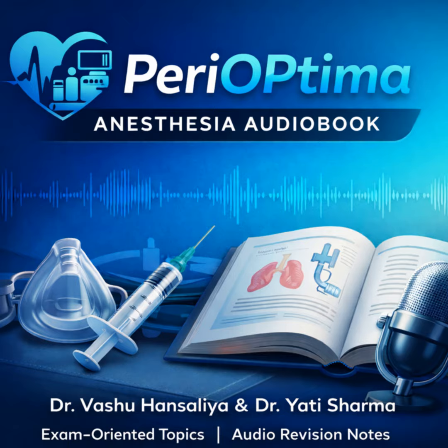Or a pinhole. Use the ice pick analogy. Imagine taking an ice pick and stabbing it through the patient. M mode ignores everything else and just shows you what is happening along that single thin line over time. So it's a graph. Depth on the y-axis, time on the x-axis. Precisely. And why do we care? Because it proves movement. It is the definitive way to prove the lung sliding against the chest wall, or that a heart valve is opening and closing. It documents motion in a still image.